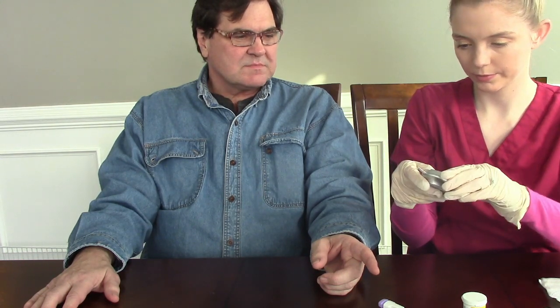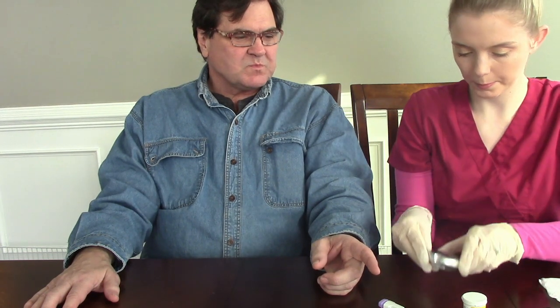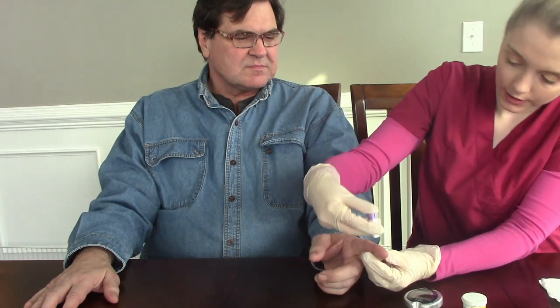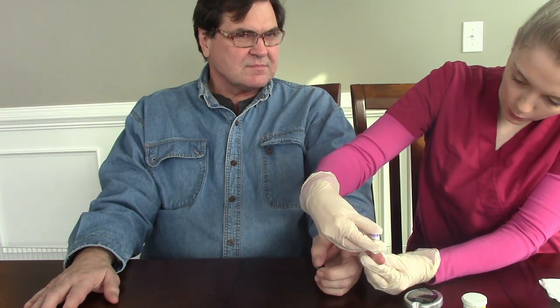While the site is drying, we can insert our strip into the glucometer. Once you insert it, it should automatically turn on. Then we take our lancet device — this is a disposable lancet, one time use only. Take off the protective cap, and now we are ready to poke our patient. One, two, three, poke.